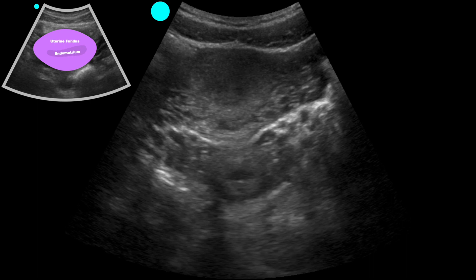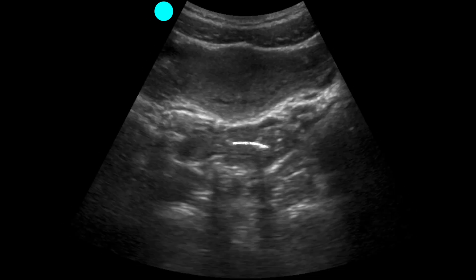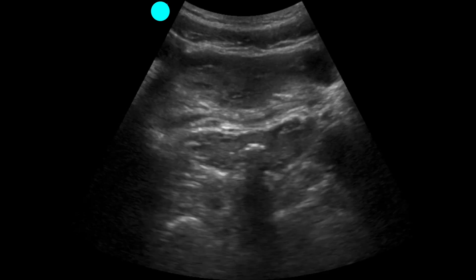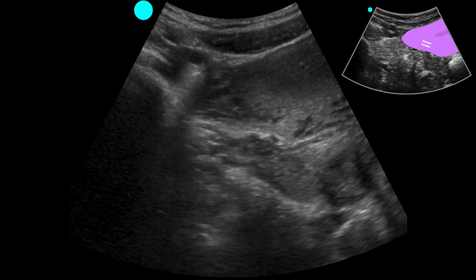We now rotate the probe to the patient's right and are in a short axis view. Since the cervix is anteriorly flexed and anteverted, on this image we have both the uterine fundus and the cervix visible. We are scanning from the superior part — the fundus — identifying the endometrial stripe, and scanning more inferiorly through the cervix. The vaginal stripe and cervical stripe are visible here, along with a little bit of bladder coming into view.